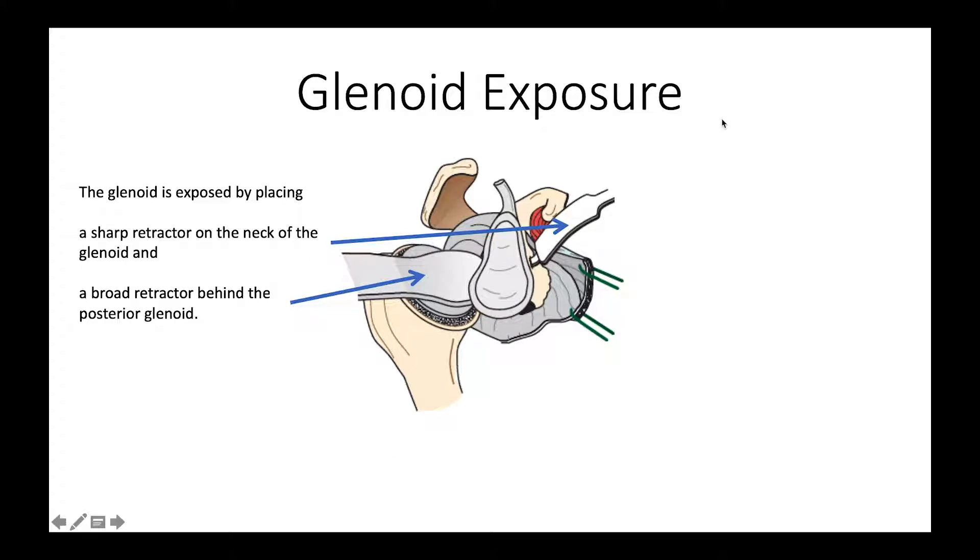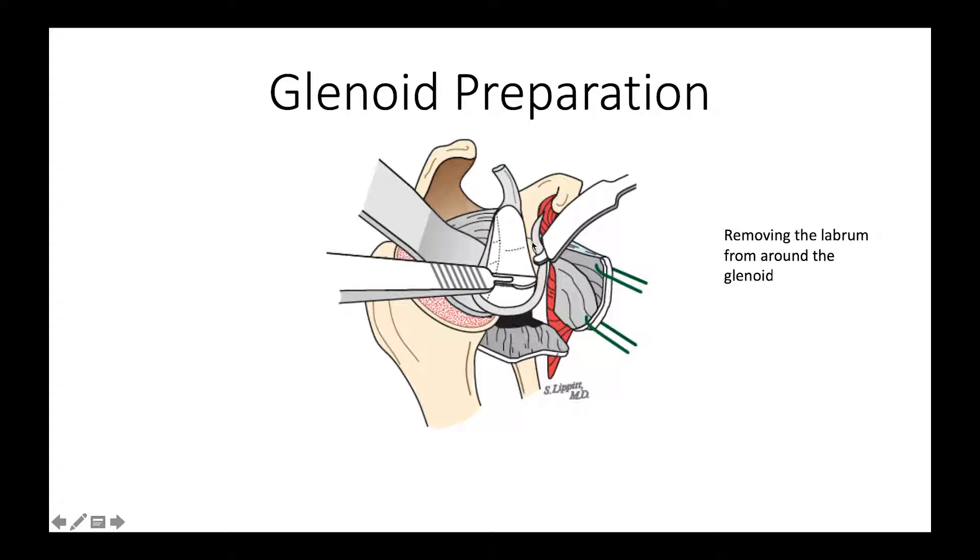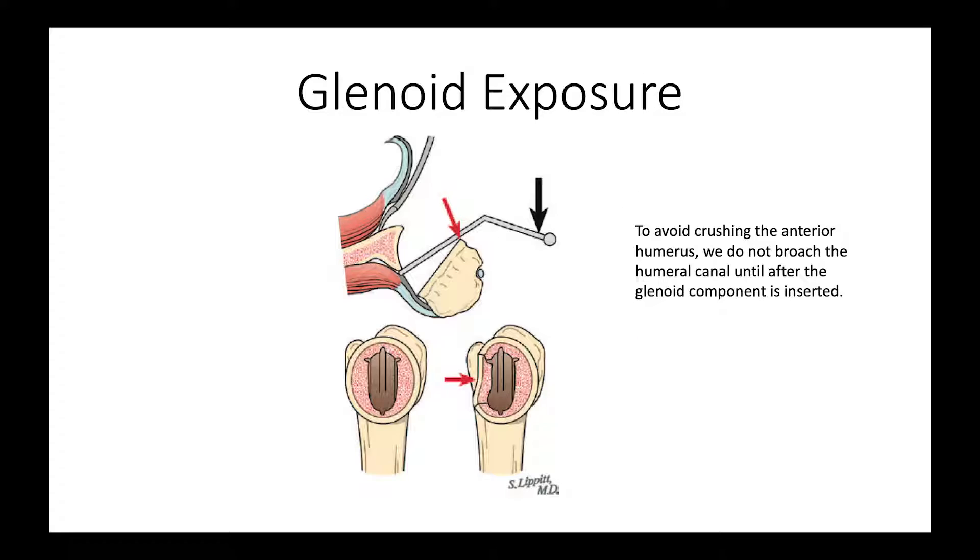We put a flat retractor behind the glenoid to protect the humerus, and a sharp retractor in the front along the neck of the scapula. We then carefully dissect the glenoid labrum from the periphery of the glenoid to get it out of the way so that our component does not rest on it and have interference with complete seating. We wait to prepare the humerus until later, because we don't want to crush the humerus in our attempts to get good glenoid exposure.